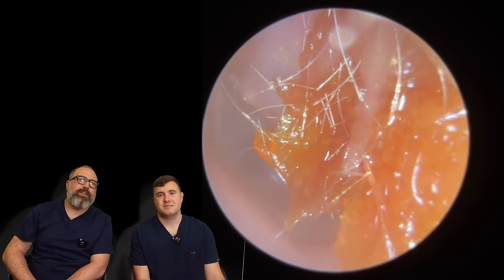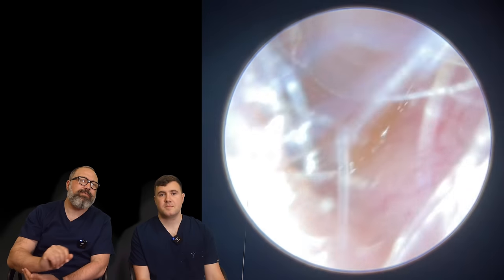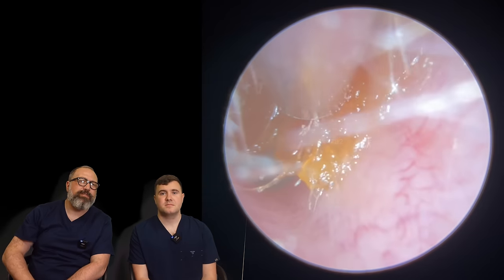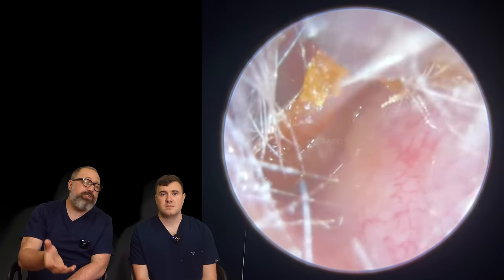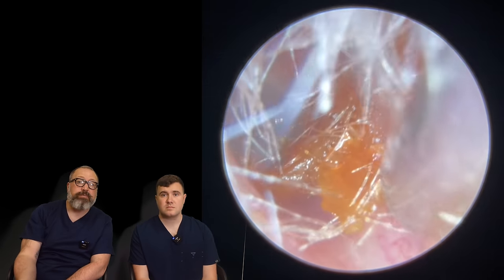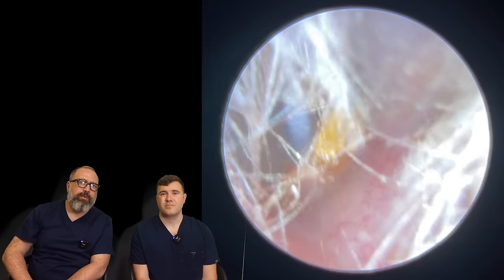Not so much on this side. This is more of an annoyance because of those kind of hairs. They noticed that when they lay on their ears, they were feeling a little bit blocked. They've got water in there, feeling a bit blocked. The patient's hearing generally is good. There's loads of gaps around it, but if you get water in there, it plugs those gaps, and the patient just doesn't feel like they're hearing particularly well.